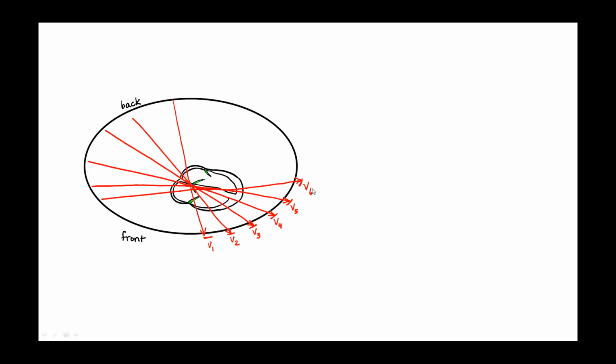So let's go back to our precordial leads, which, as I'll remind you, sit like this on a person's chest. And remember that this is the front side of the person's body, and this is the back of the person, and the leads run like this. So here's the question. Pretend that you have a healthy patient. You're looking at the voltage tracing from each of the precordial leads, that is V1 through V6. Out of these 6 different precordial leads, which one is going to have the highest amplitude voltage on the tracing, and which one is going to have the lowest amplitude voltage on the tracing?